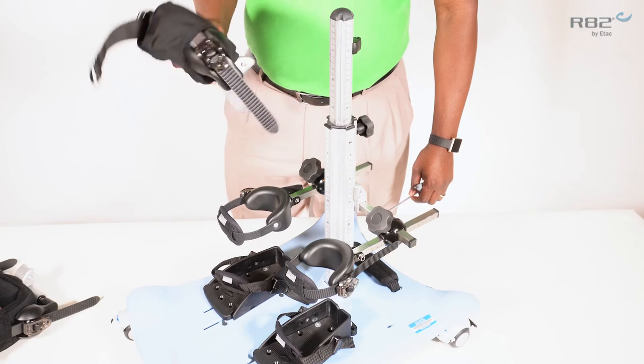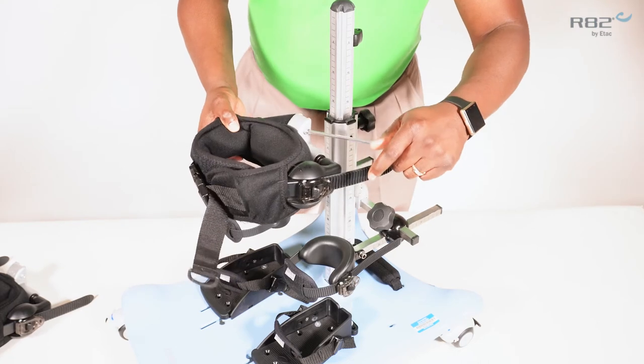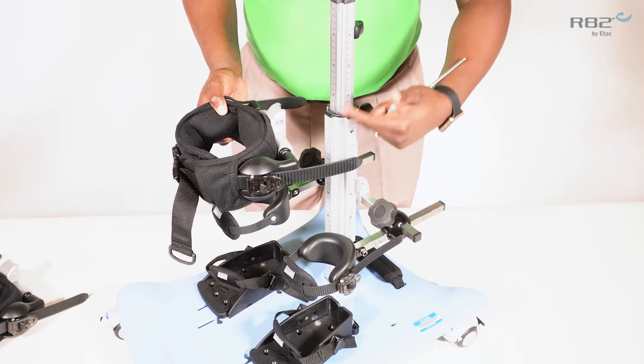To install the pelvic support and the trunk support are very similar to installing the knee support. The pelvic support will mount on the height adjustable column.